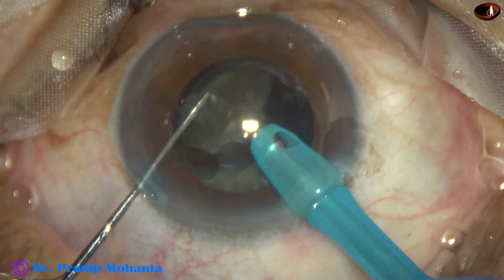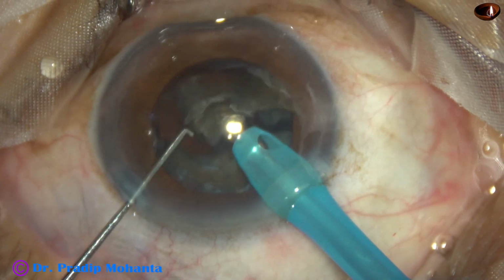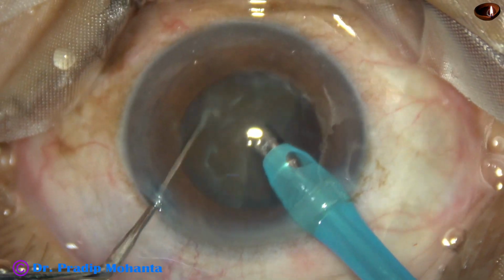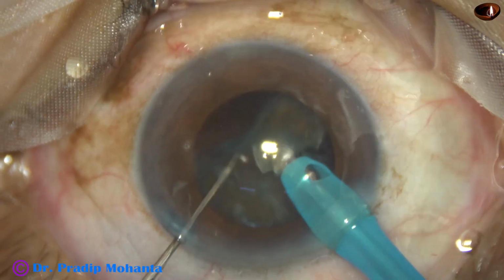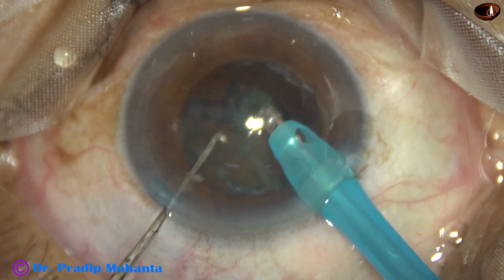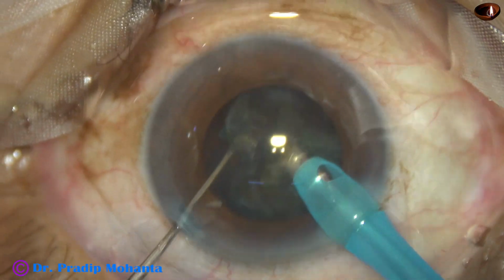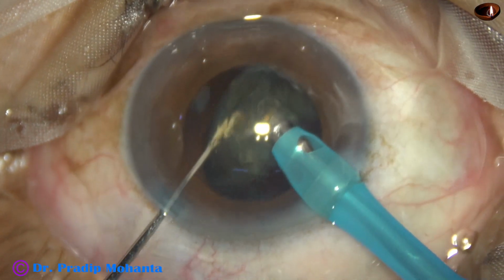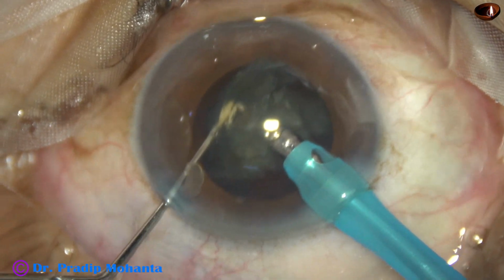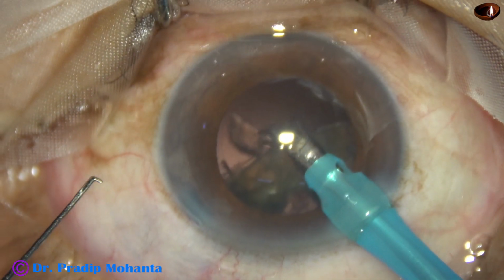Hold the second piece, emulsify. The nucleus is not hard. Nuclear sclerosis is about grade 3 or grade 3 plus. Ultrasonic energy used is 70%, flow rate is 40, vacuum is 400 millimeter of mercury. And this is the last piece.